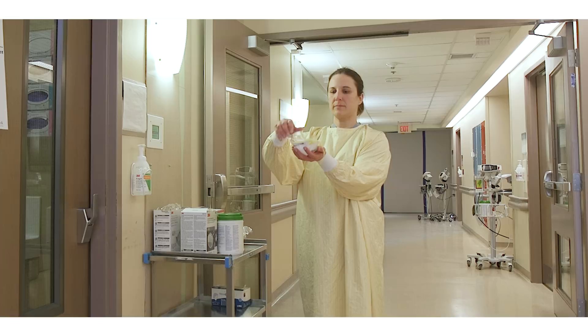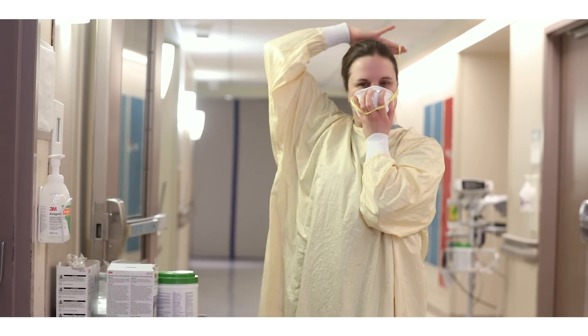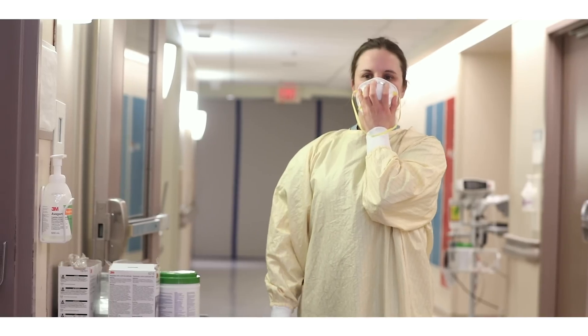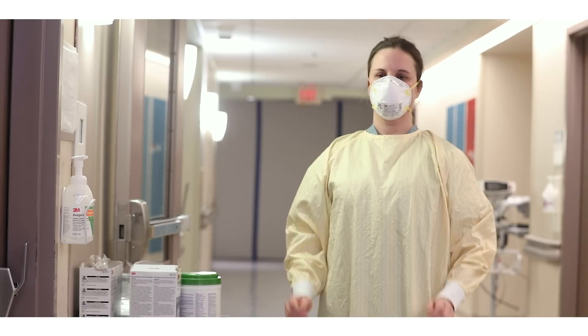Lift your chin and place your fit-tested N95 respirator over your nose and mouth. Stretch the bottom strap over your head and place it on the back of your neck. Ensure the strap is on bare skin only with no loose hairs. Place the top strap on the crown of your head. Ensure that the straps are not overlapping or crossed.